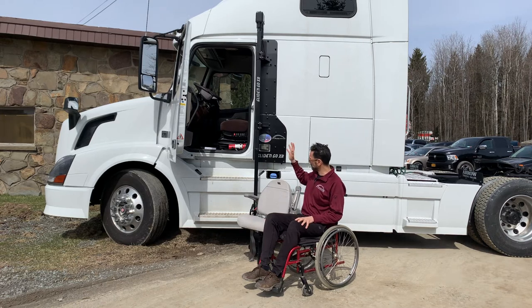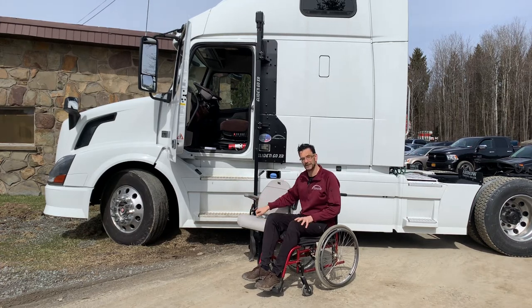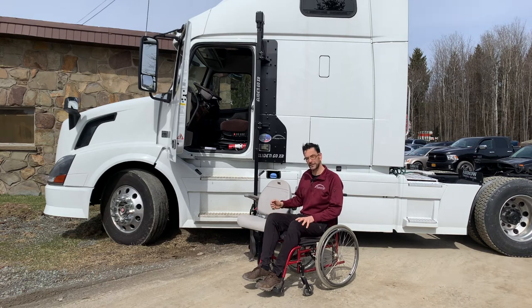The Glide & Go XR mounts on the side of the rig. It's got a removable seat, and it allows you to get up inside your vehicle safely with the locking mechanism here. It'll allow you to transfer into your seat and get up into your big rig.